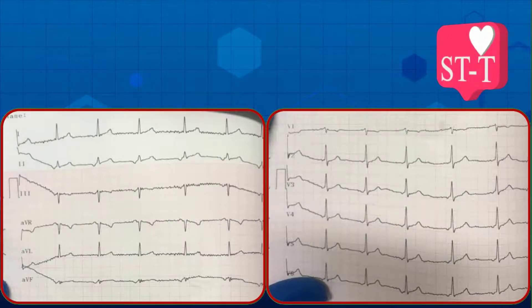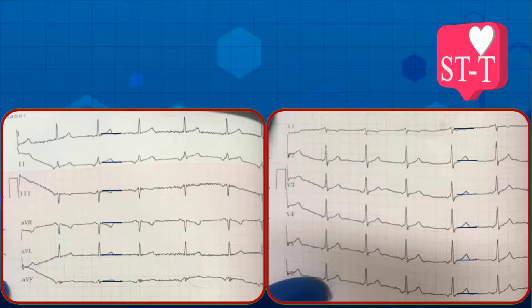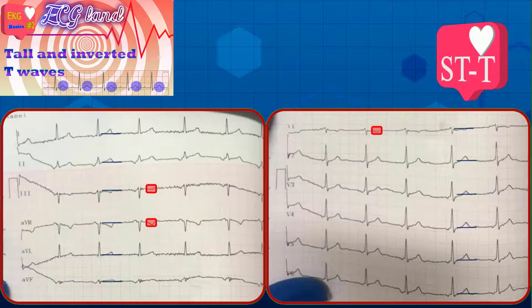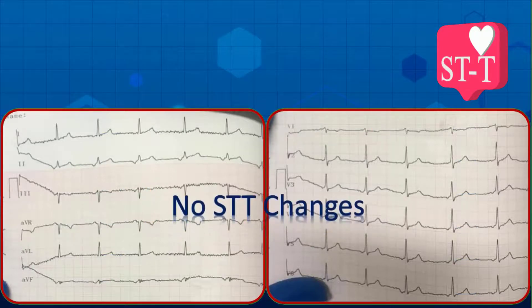Next part is examining ST-T changes. There is no obvious ST elevation or depression. The T waves are positive in all leads except AVR, D3, and V1. As stated in episode number two, inverted T wave is considered a normal finding in D3. So there are no abnormal ST-T changes in this strip.